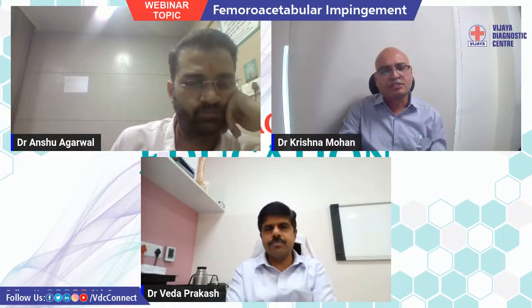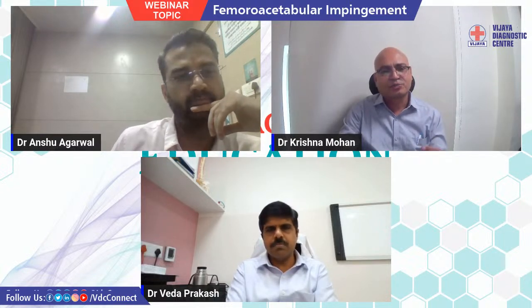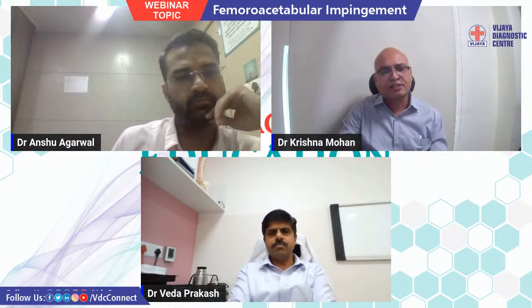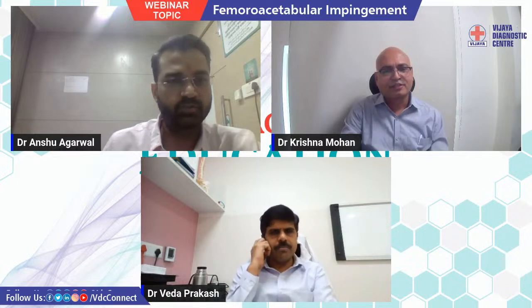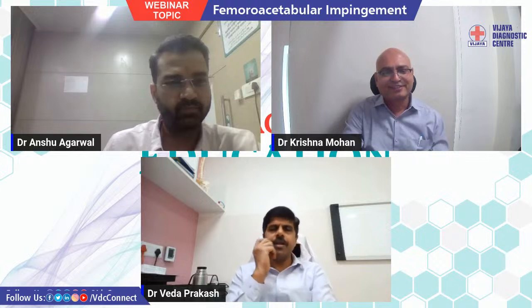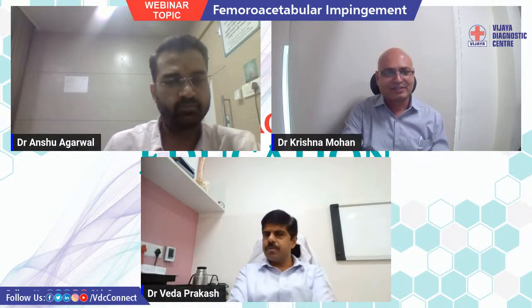If we try to see a larger area in one scan, the resolution will fall and we cannot see tiny structures like labrums and small ligamentous structures. This applies even for the ankle. If we try to include the entire foot and do the ankle, then the resolution is not enough to see small ligaments like ATFL, CFL and others. The same applies to any area. If we have to look for some ligament in the thumb, we have to specifically study the thumb only, not the entire hand.